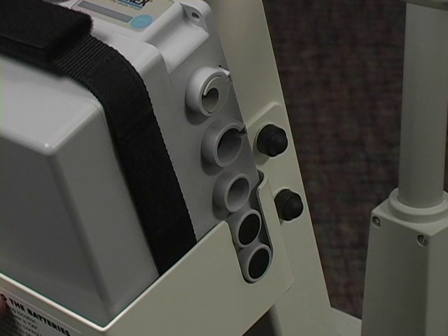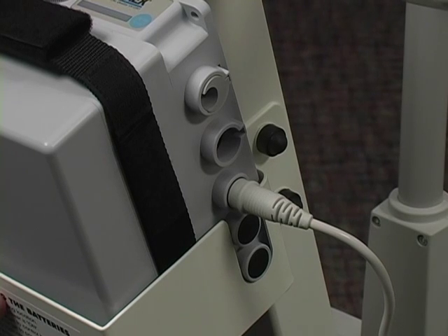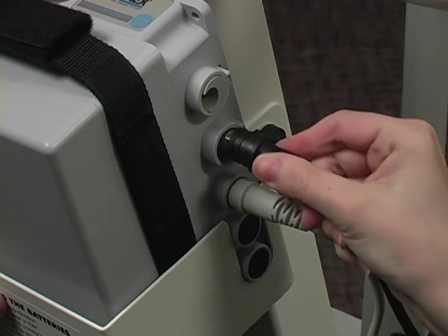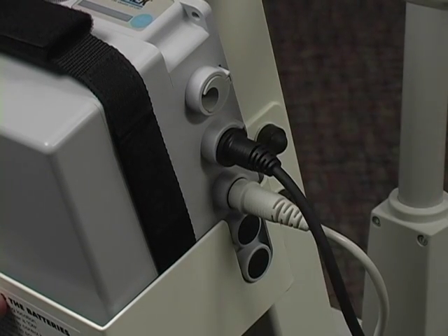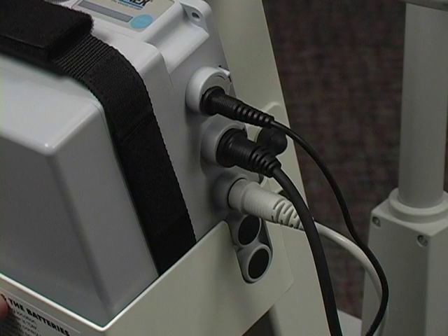There are five openings on your battery pack. The actuator motor plugs into the third opening. The hand pendant plugs into the second opening. The charger plugs into the top opening. The lower two openings are not used.